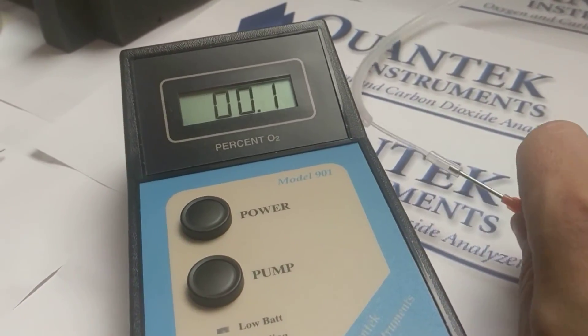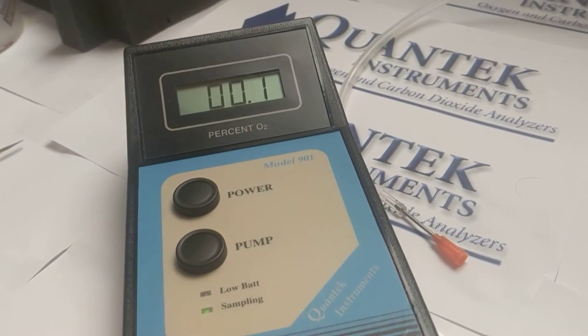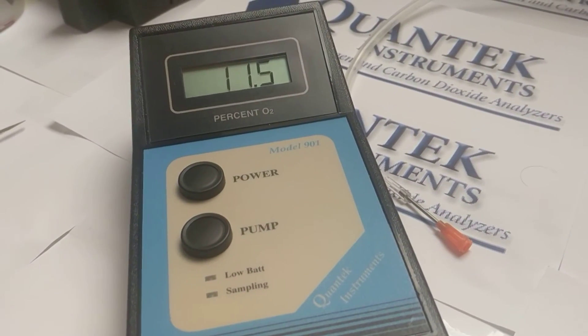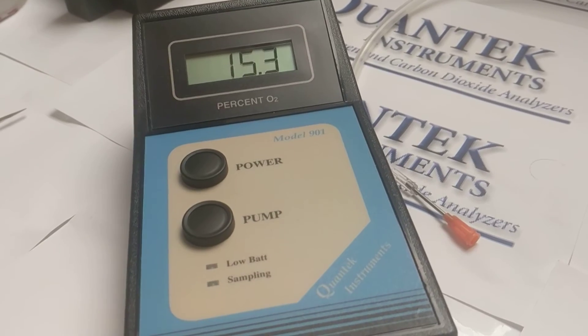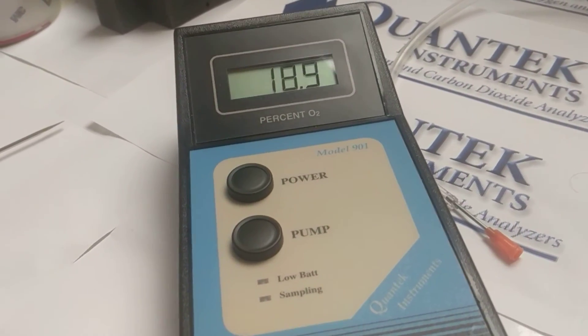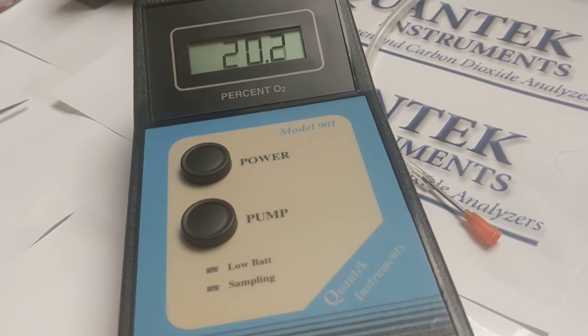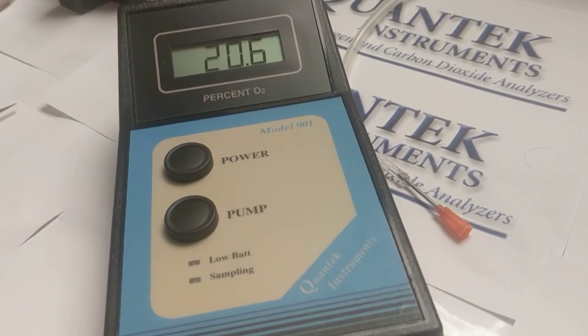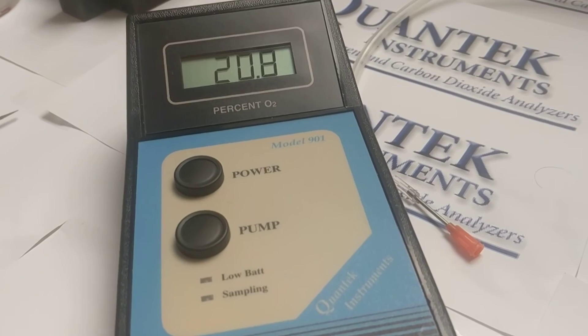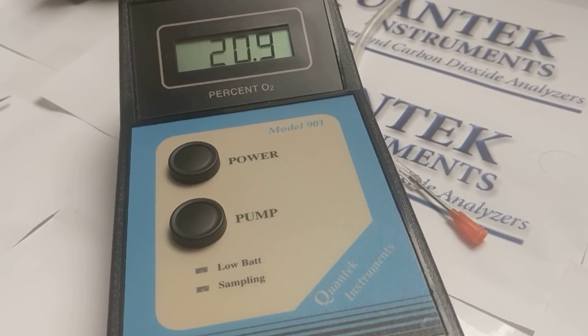And for the final test, what we're going to do is press the pump button. And we should end up at 20.9%. But again, the sensor has an accuracy of plus or minus 1% of concentration, which means that if it starts at 20.7, 20.8, 20.9, 21, this is going to be statistically insignificant once you test a package that has say less than 3% oxygen in it.